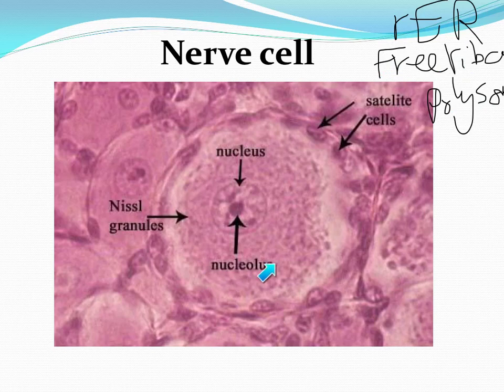What is the significance of these Nissl granules? Their number varies according to the functional state and the neuronal type.